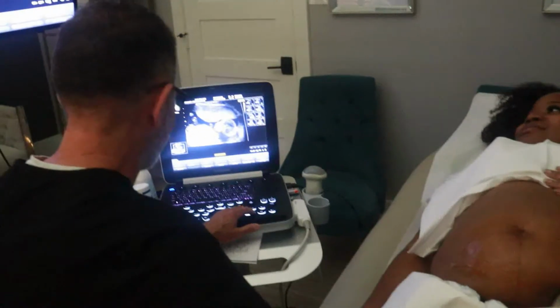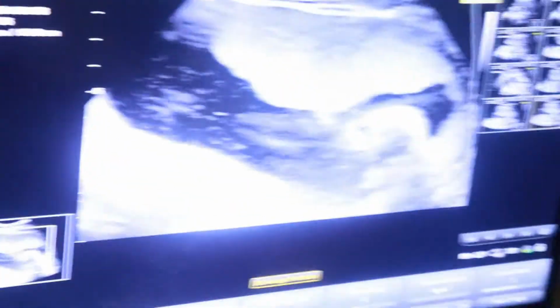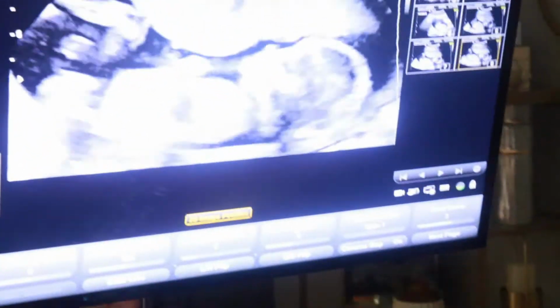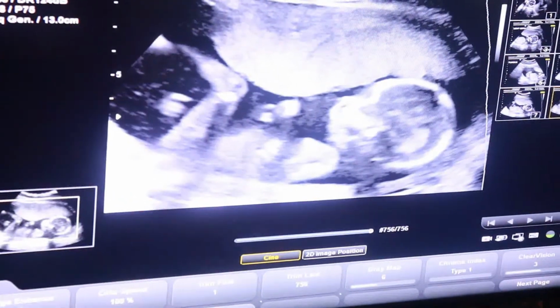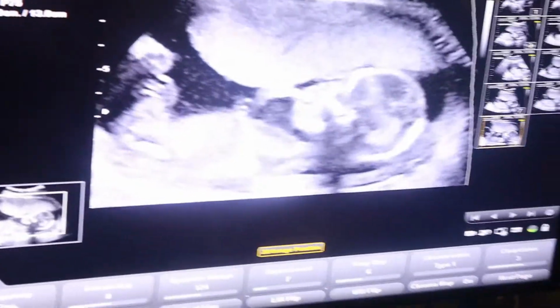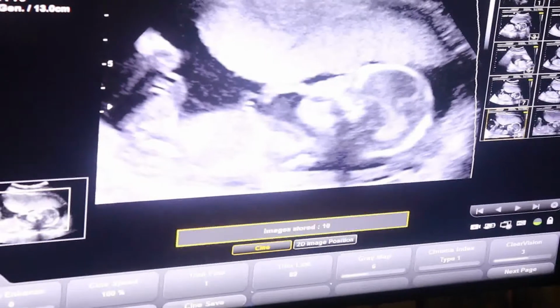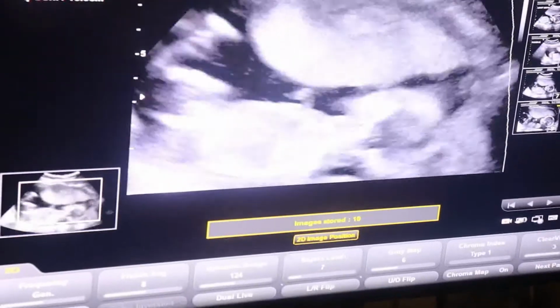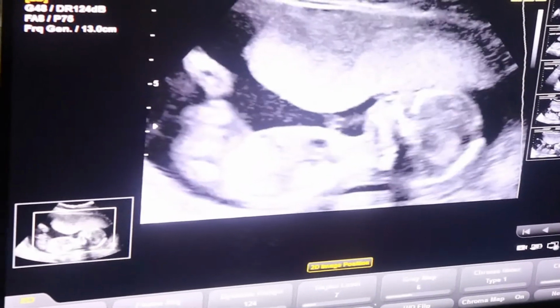Oh, look at his little hands moving. Oh, you're seeing the umbilical cord there. I'm going to give you a good look at this real quick. That's the actual cord. Baby's huge. Trying to eat that little hand in there. Oh wow, that's so cool. You can literally see the fingers.